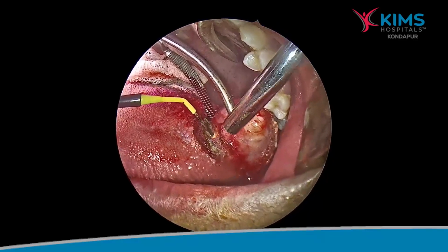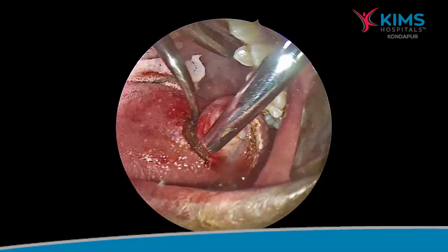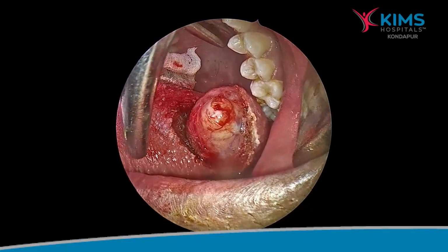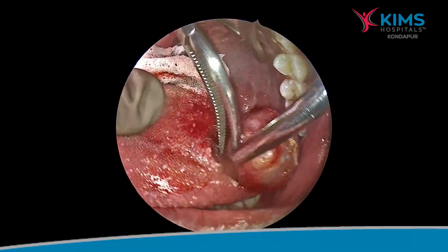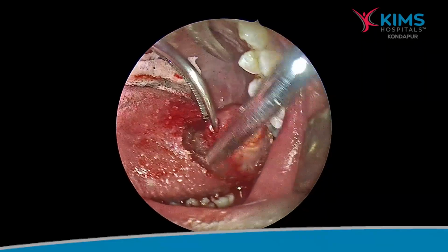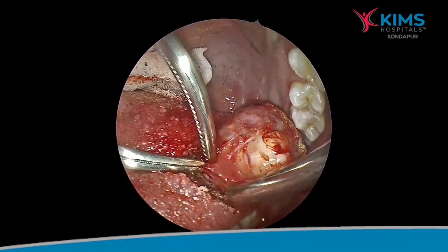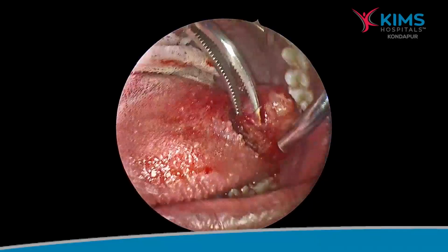For final dissection, again we are using the radiofrequency needle in a slow, phased manner, keeping in mind that the lingual artery will be about 1.5 to 2 centimeters deep there, but somewhat medially. So that is the plane of dissection again.